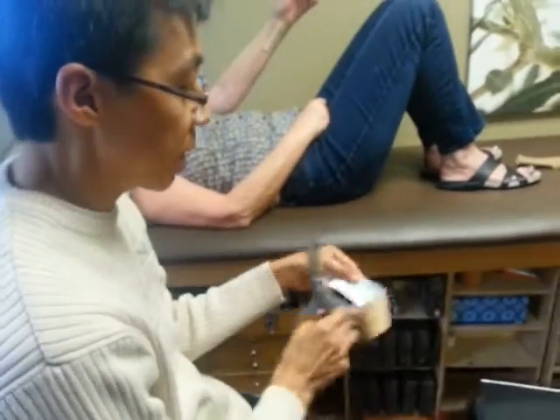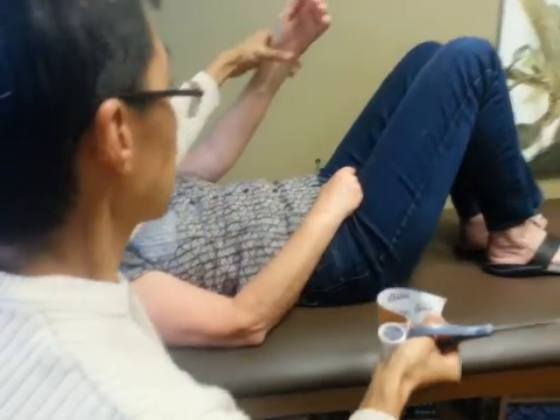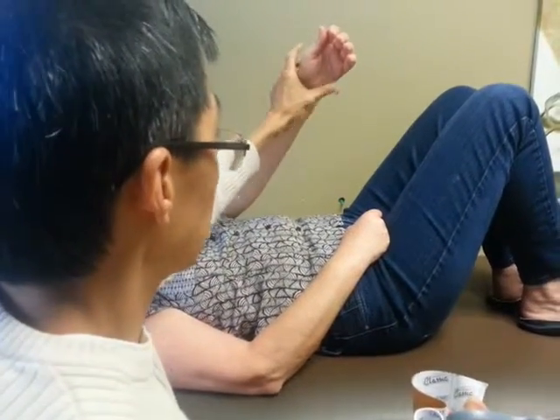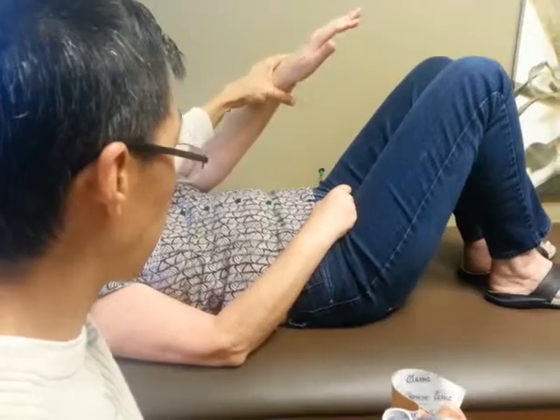When you're doing kinesio tape, what you want to do is you get basically the blocks. You measure how much the person needs. So in this case, we're doing the wrist. There's a lot of swelling in the wrist here from a fracture, and so there's limited mobility. Go ahead and try moving it from side to side — she has hardly any mobility because of the whole inflammation right here.